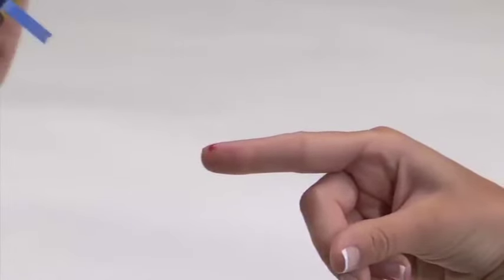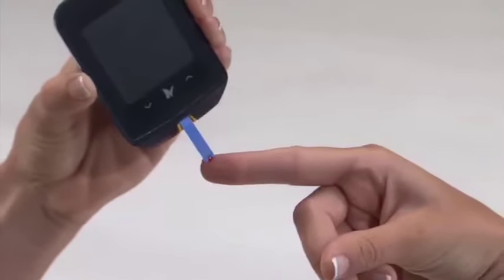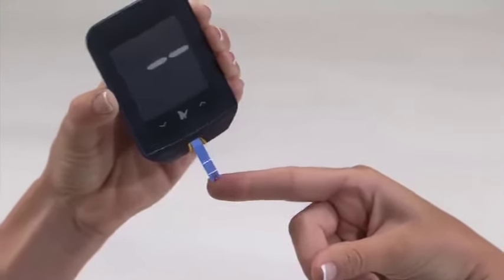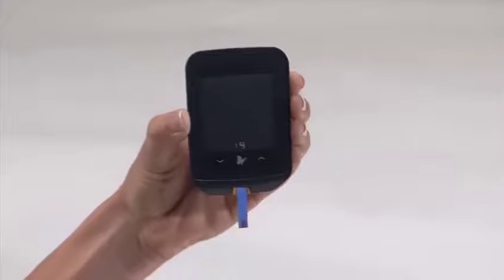Apply the blood drop to the white area at the end of the test strip until you see three dashes on the meter. This means you have applied enough blood.